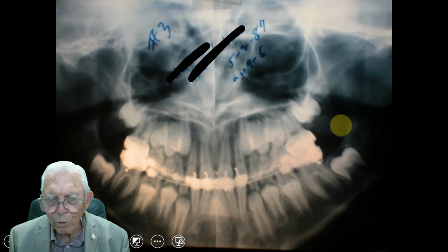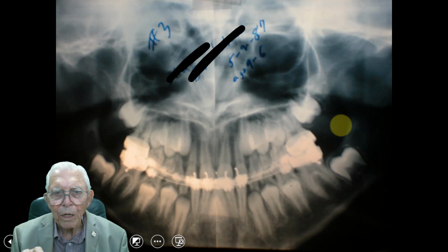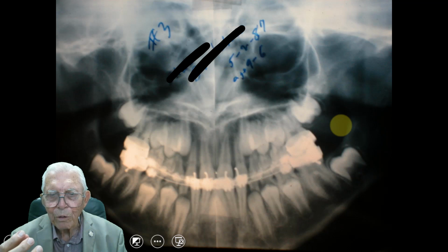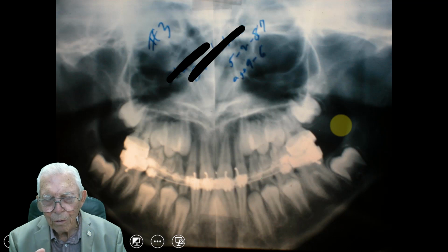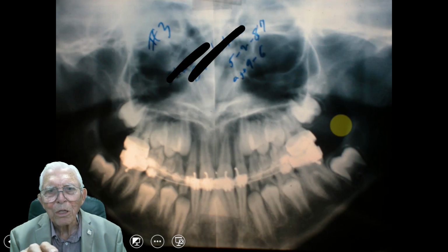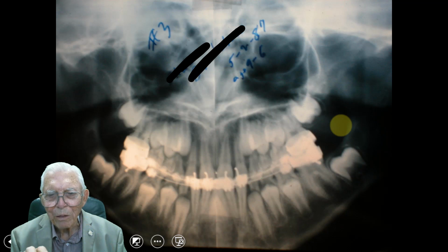So anyway, we got these little fingers back there, and those work. I mean, we put those on, we don't mess with that tongue. The tongue will go up there about twice and hit those little sharpened wires. They don't have to sharpen them, you just go up. And I had this on a medical doctor who was a bad tongue thrust, even after he was out practicing. I put these on him, and I said, I want you to tell me exactly how your teeth get along on here. And he told me, my tongue went up there and hit them about twice, and it irritated it. And after that, the tongue won't even go up there close to them.